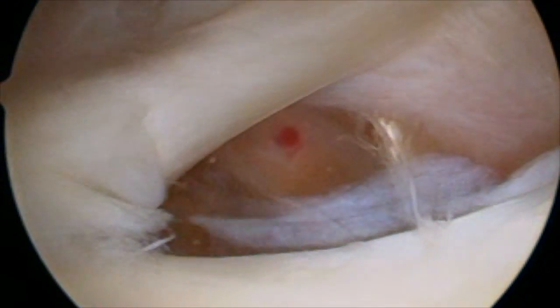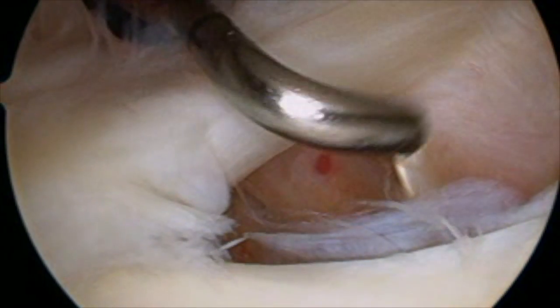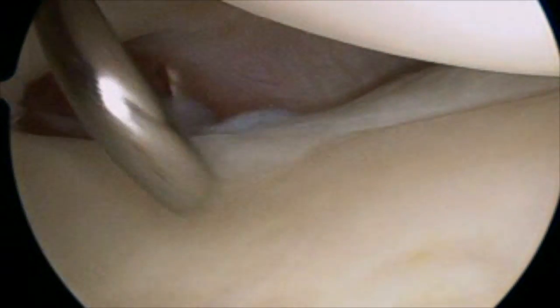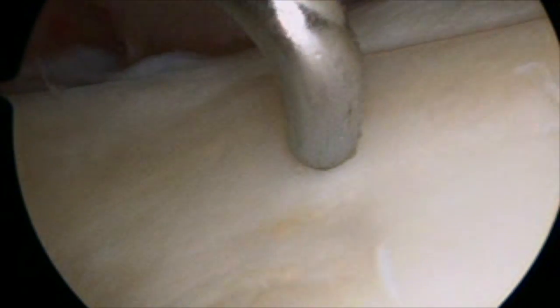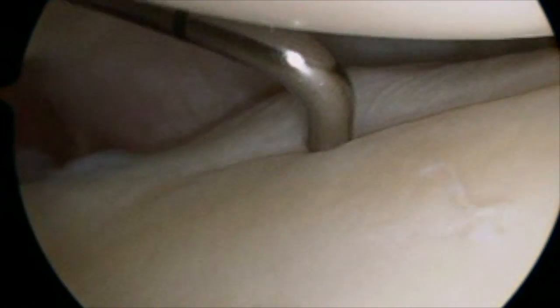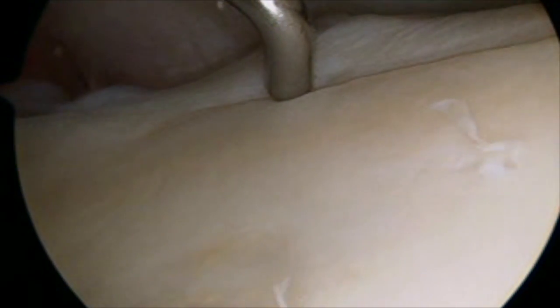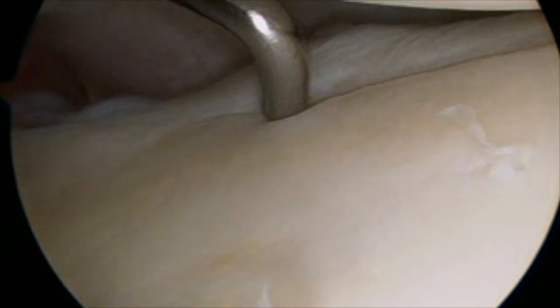Once the cannula is established, I can use a probe — an instrument that I use to touch and feel. The tip of this is about four millimeters. I'm feeling the cartilage of the glenoid or the socket down towards the bottom and the front of the joint. I'm feeling the transition to the labrum right here. And this is where the ligaments attach in the front. I'm running this at about 50% normal speed.